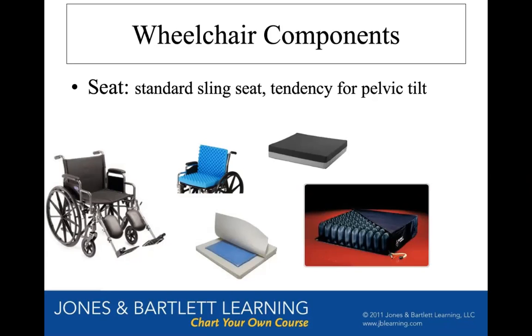Now, these other ones that are shown are specialized cushions. Let's look at this one below the blue cushion. It's a blue square surrounded by gray, and it's got the cover kind of pulled back. That blue in the middle is like a rubber well of gel, a semi-solid, gel-like substance, and you sit on this.